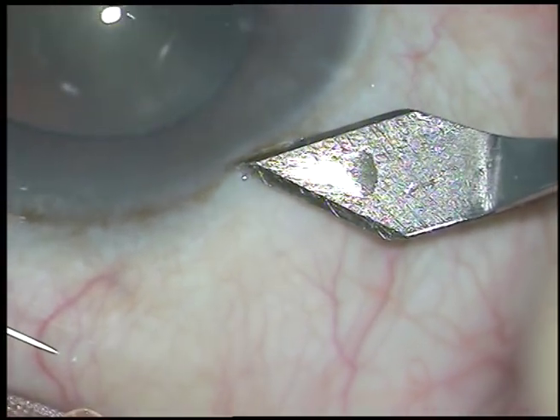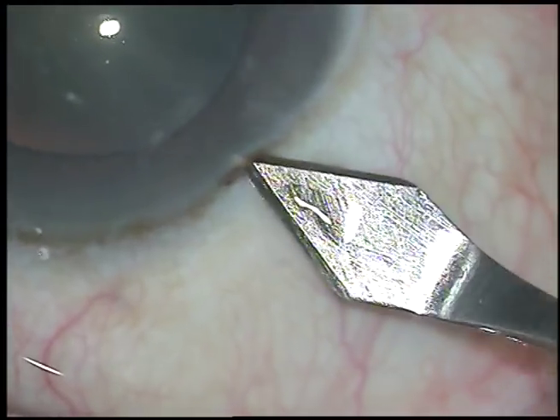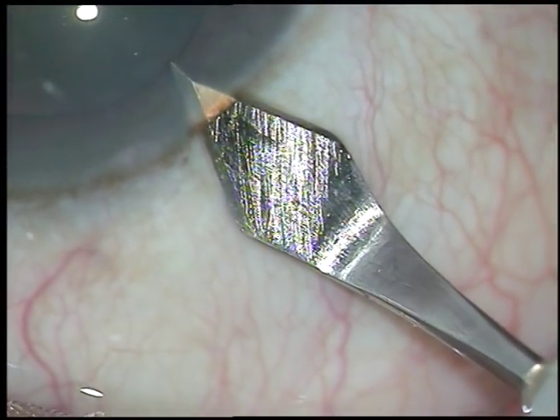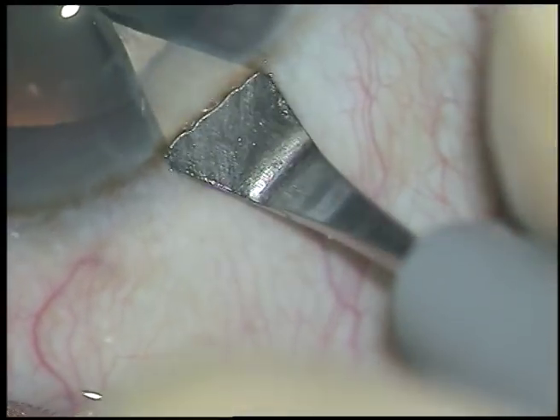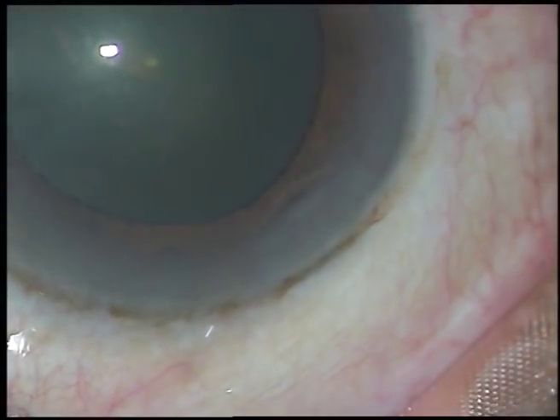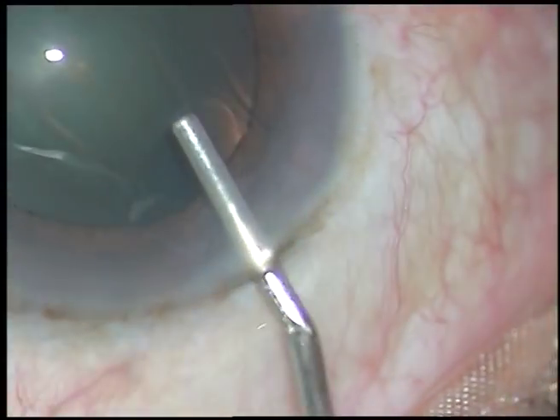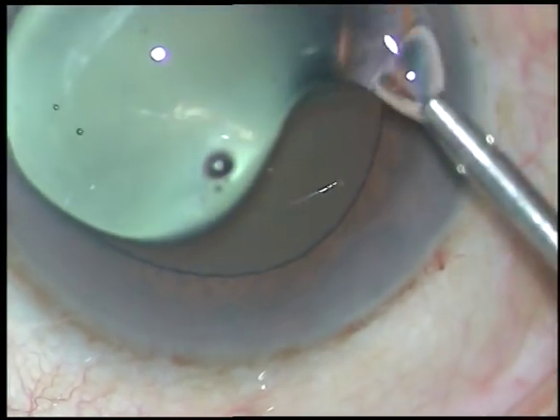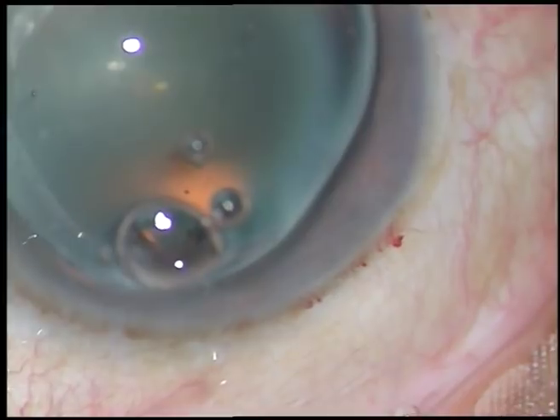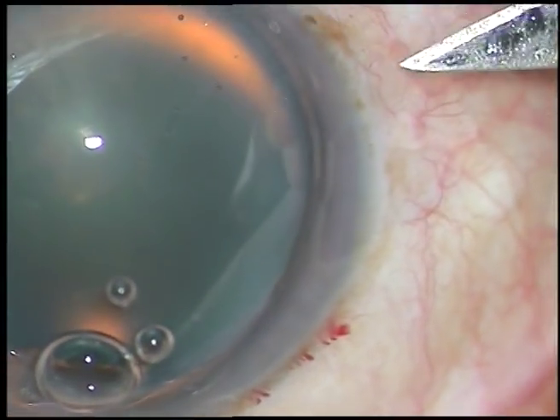This is how I make the incisions. This is a cut by the edge of the keratome. Now gradually I go for some distance and then dive into the anterior chamber. Now I inject viscoelastic substance into the anterior chamber. It is also applied over the corneal epithelium for better visibility.